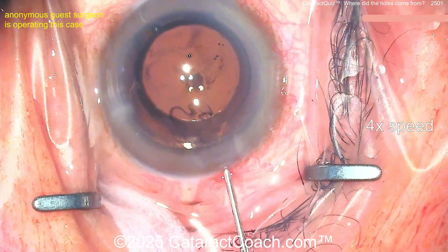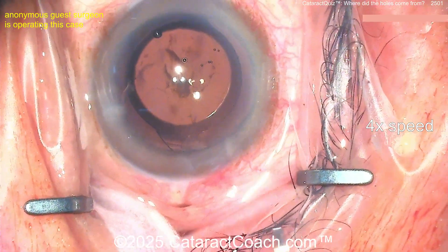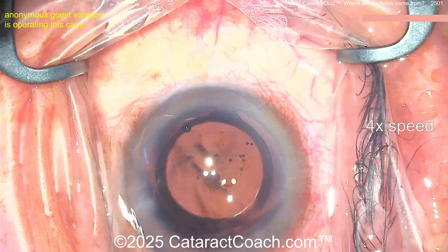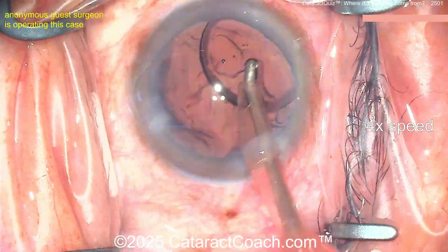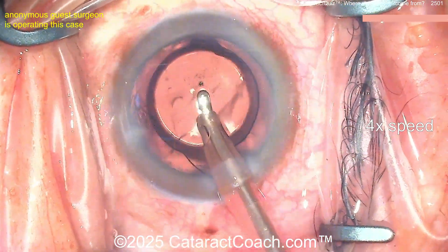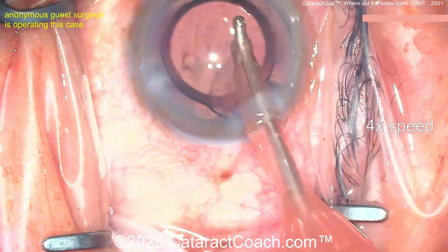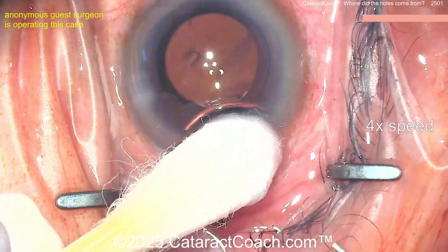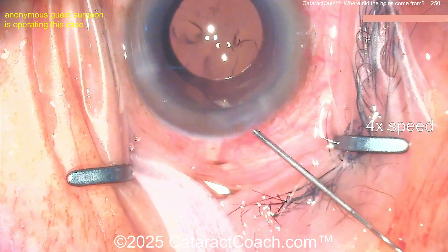I like this idea: hydrate the incision first, then settle the lens. Watch out for some viscoelastic. I still think you can go behind the lens optic to remove the remaining viscoelastic. What I'd do is go in slower — cut the aspiration flow rate in half, maybe cut the vacuum level in half too. Just go in there gently. Going in front of the optic first, then going behind it — be gentle, don't have too much manipulation of that bag. If you need to, leave a little viscoelastic behind the IOL optic; it's not that big of a deal. And there you can see those are the two holes. Round holes like that — my suspicion is they're from the phaco tip. I think there's a video frame where you had a little capsule touching the probe for just a fraction of a second.